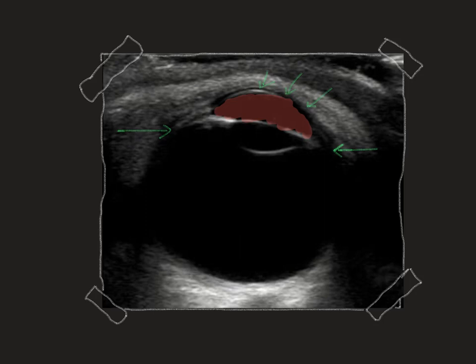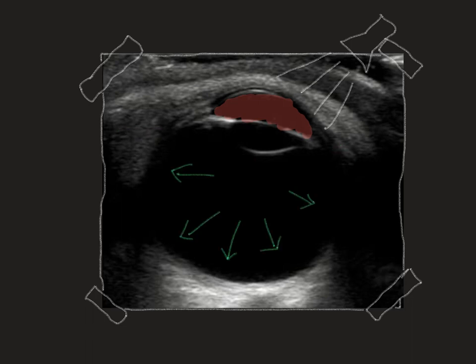You can actually assess pupillary response by shining a light to one of the eyes. The next structure is the lens. It is anechoic. Vitreous chamber. It is filled with anechoic fluid. Retina. It cannot be differentiated from the other choroidal layers.